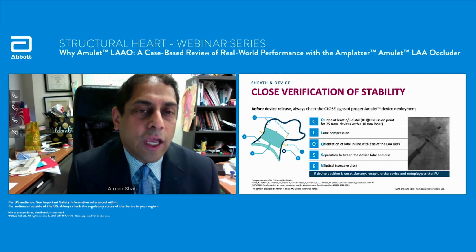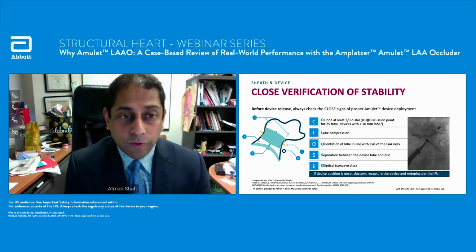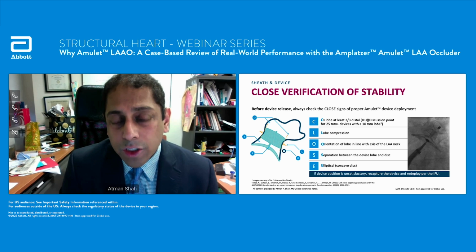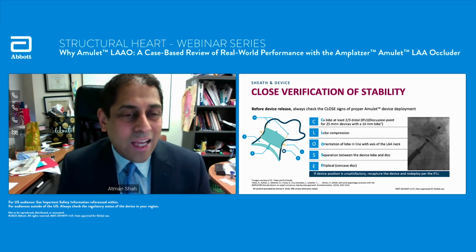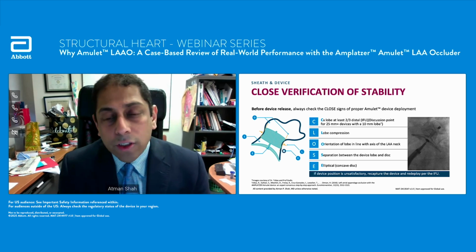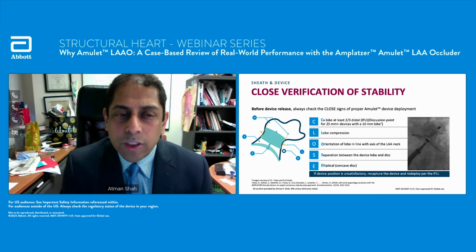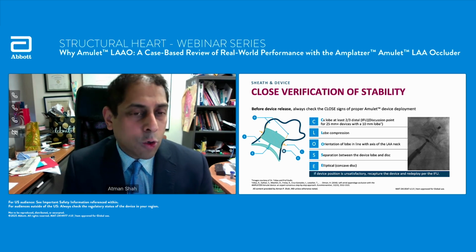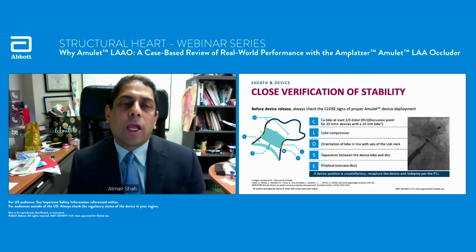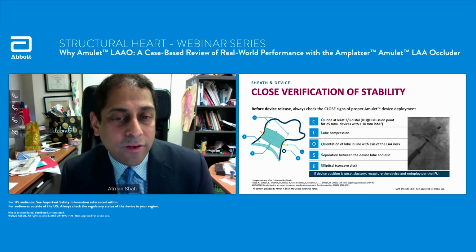The CLOSE verification of stability, the C: you want to make sure the lobe is 2/3 past the circumflex. L is adequate lobe compression. There doesn't need to be an exact determination of what percentage, but you do want to see lobe compression, whether it's commented as a flat tire or a Roman helmet. That's adequate lobe compression. When it starts to look like a strawberry or something more smushed, that's too much compression, and you may not have a good seal. O is orientation of the lobe, which should be in line with the axis of the left atrial neck.